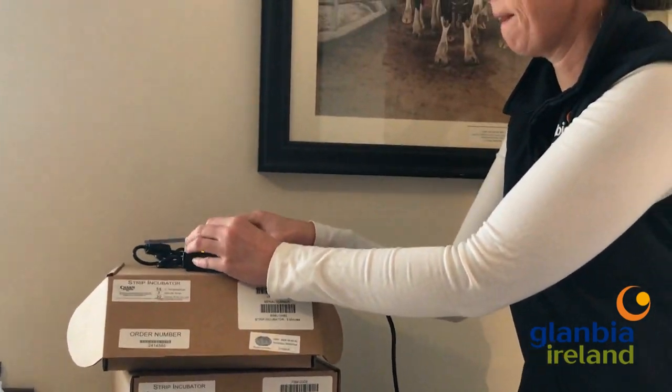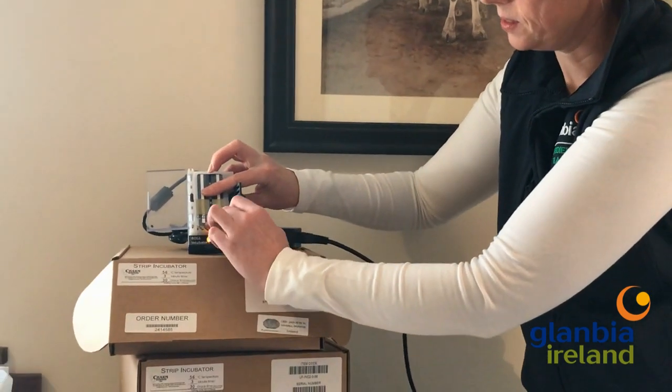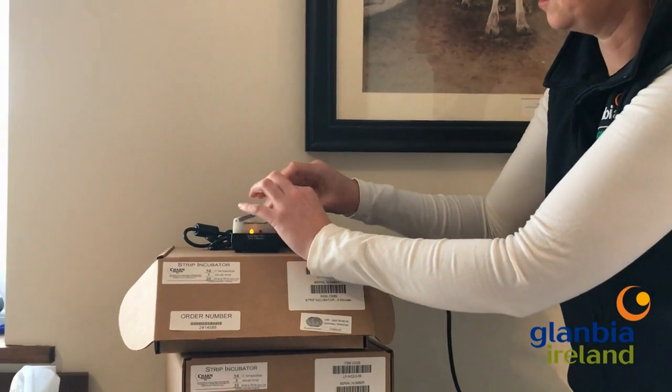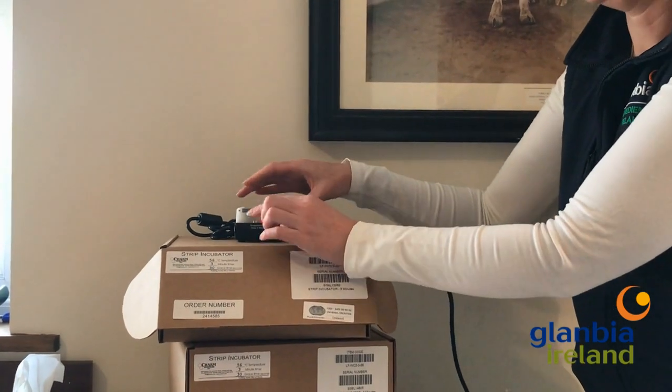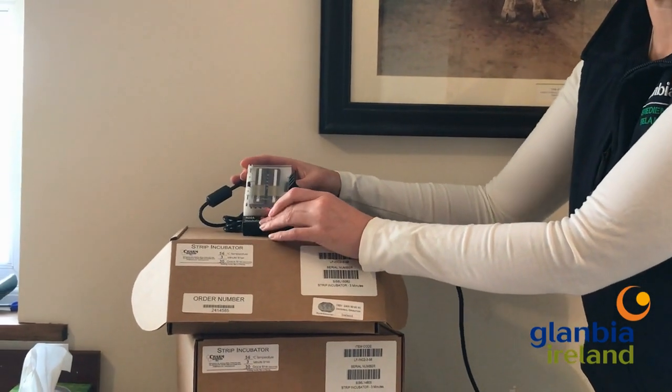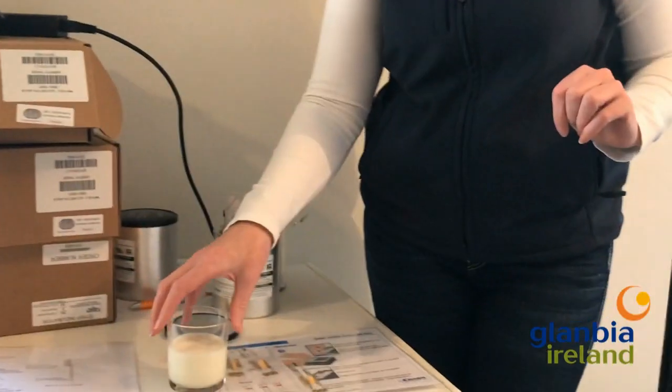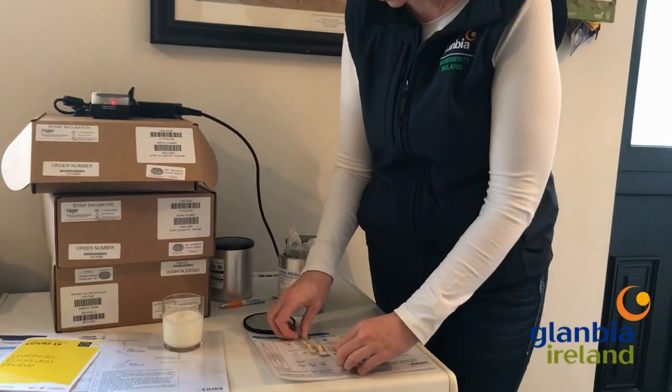Seal it down. You can see the little white line — seal down your tabs and close it. The flashing orange light is when the incubator is heating up, and the red light is when it's timing. That'll keep going for about three minutes and it'll beep to let you know it's done.